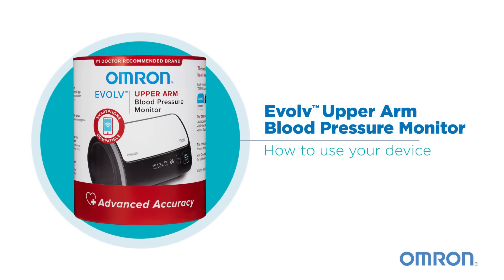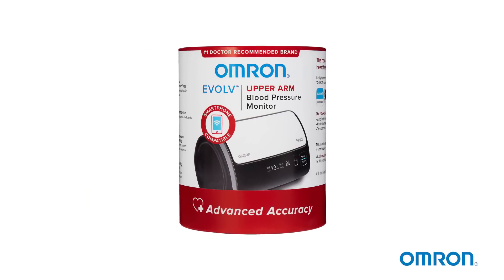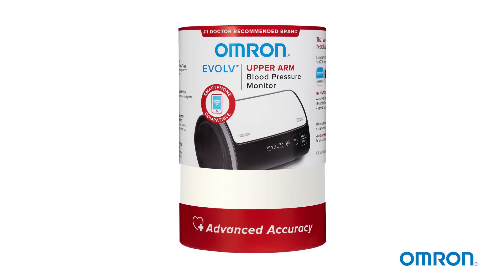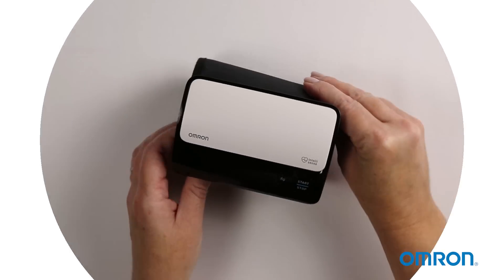Omron's new Evolve upper arm monitor makes it easy to take your blood pressure anywhere, anytime. Its compact sleek design has no tubes or wires, so it's highly portable and easy to use.